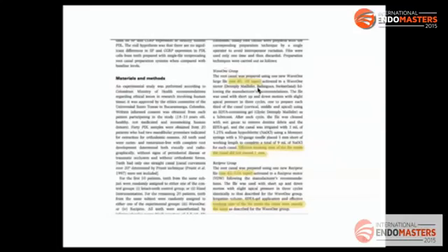Here, which one is the result? If you have a bigger file and this file goes at the same time, at the same speed, into the canal, which file is going to cause more extrusion? Always the bigger one, which is normal. So in my opinion, most of the studies are looking for a result to defend, to get the best result for their own system, the system they are talking about.